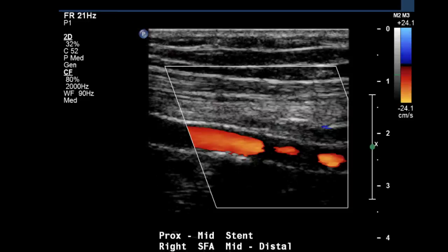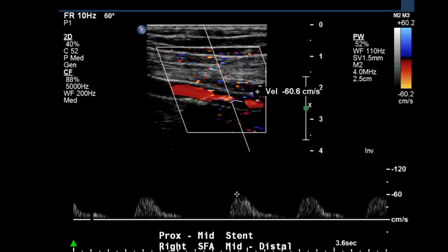Now we've continued on and moved further downstream. The velocity is now 60 to 61 cm per second. So you can see that decreases from the 531 and drops back to 60. That is a significant stenosis.